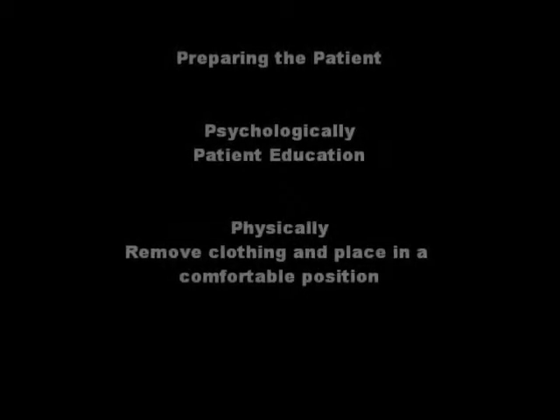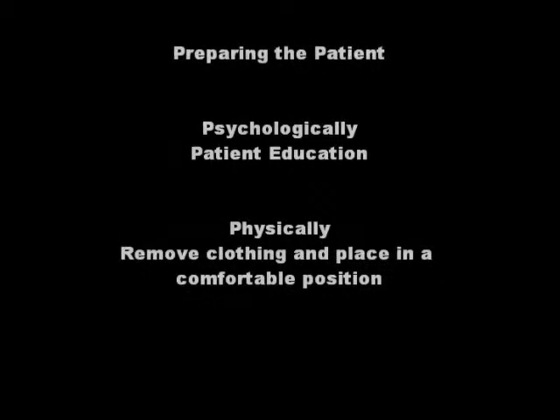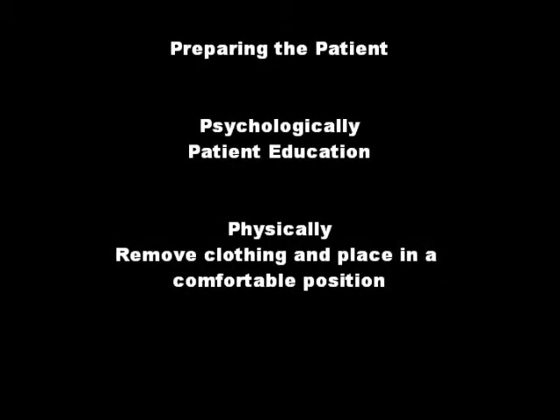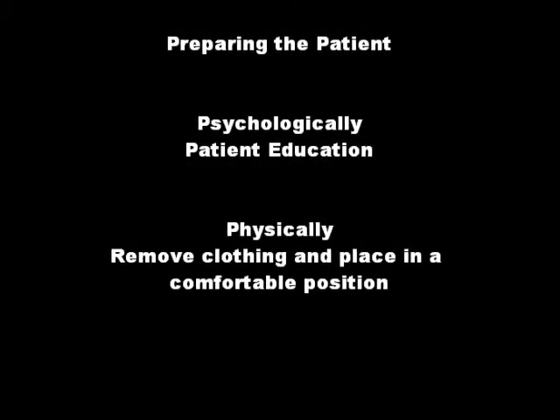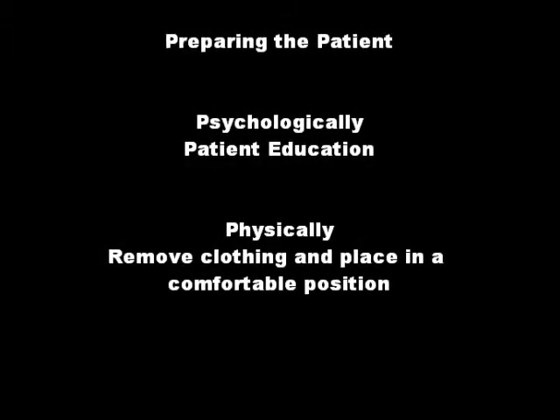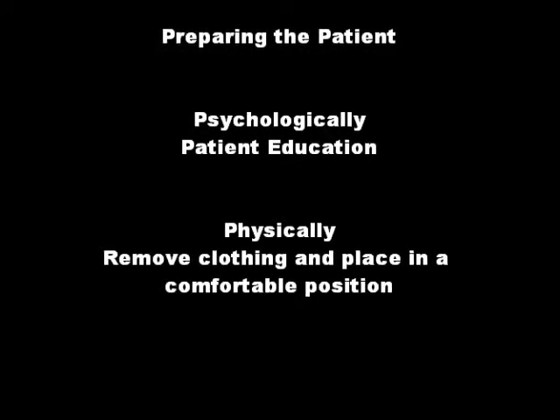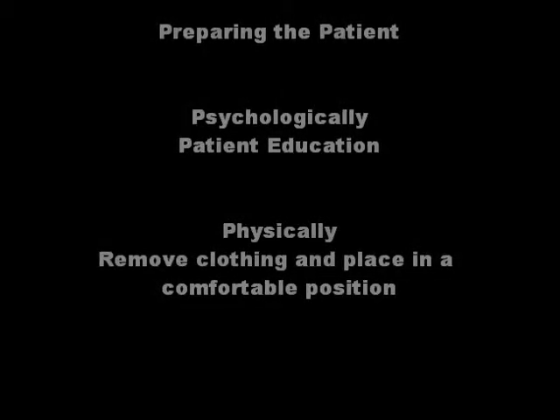Next is to prepare the patient both psychologically and physically. The patient should be educated about what sensations they will feel during the treatment. The patient will feel ice-cold water being pumped through the unit, in addition to an intermittent compressive force that will begin distally and gradually move proximally. Explain that the patient may feel some discomfort as the unit provides compression, but the treatments will gradually become less painful as the swelling is pushed out of the injured area. To prepare the patient physically, remove any necessary clothing and place the patient in a comfortable position.